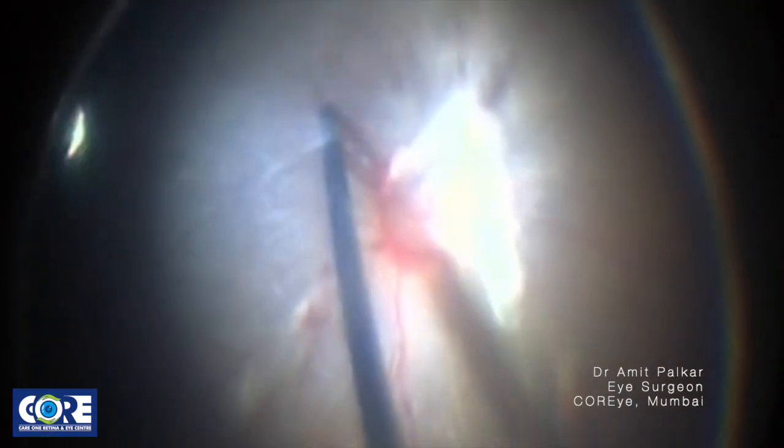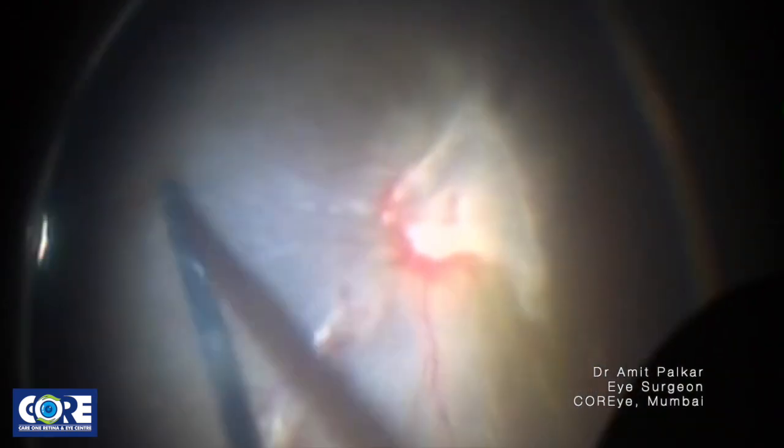Again, the blunt spatula to dissect a little further, advance the plane as much as possible, taking care not to damage the retina. Very often you find small twigs of new blood vessels or new vascular fronts attached to the posterior hyaloid, and that's how the disease is.